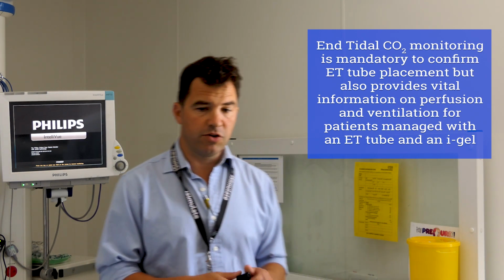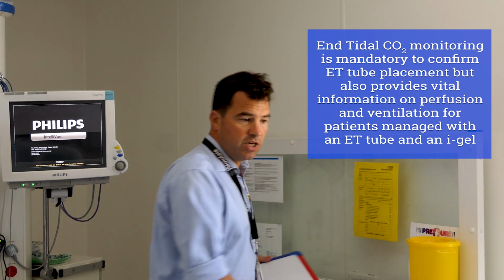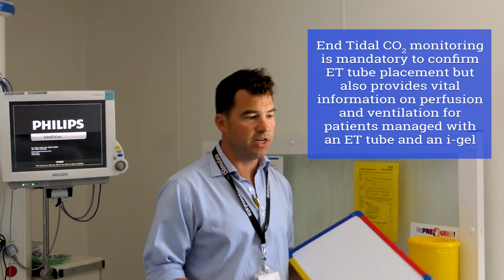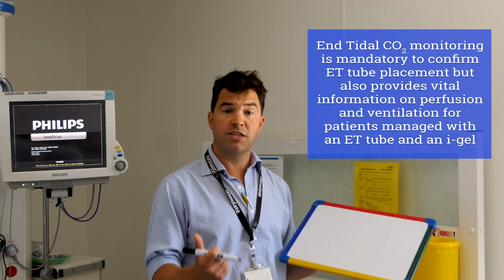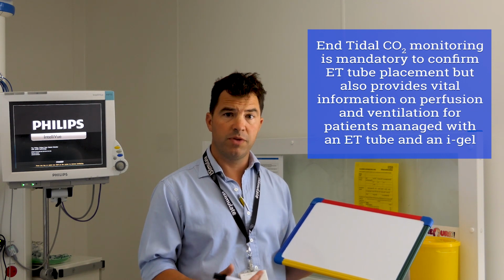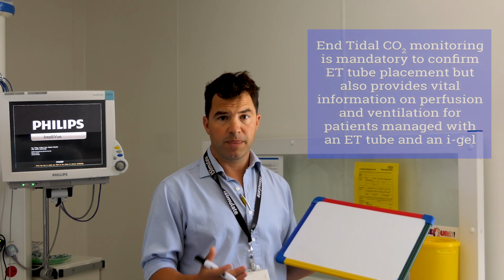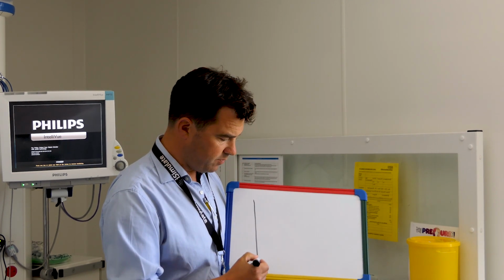So we'll talk about the CO2 waveform first of all and what you'd expect to see. Obviously we're using CO2 to give us an indication of tracheal tube placement. So it's a binary: is the tube in, yes or no? If it's in, we should get a CO2 waveform and we should get a good waveform. We should say that in your patients, post-cardiac arrest, the waveform might not be as good as we would see in anaesthesia. We'll look at a classic waveform here.